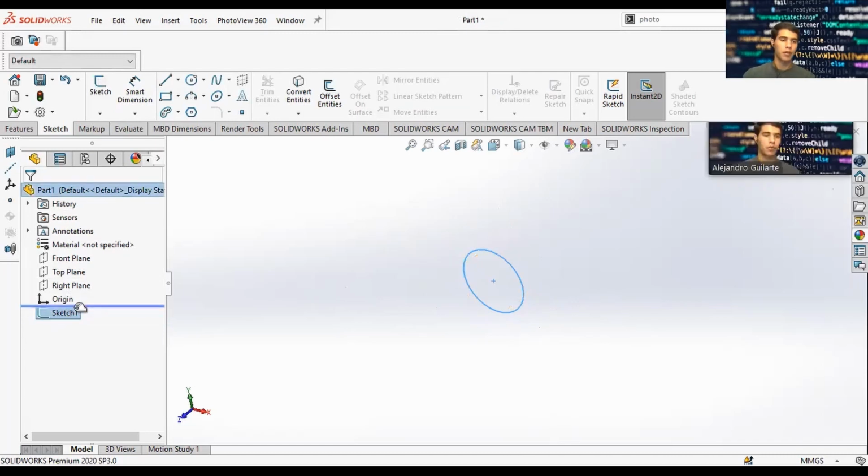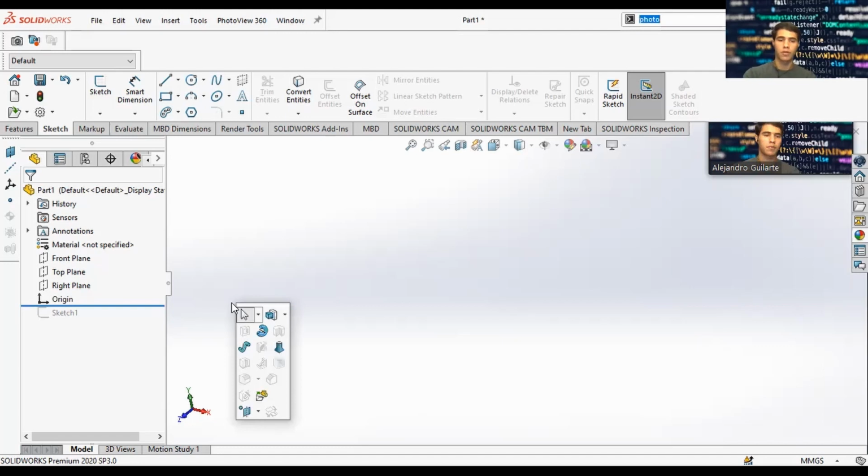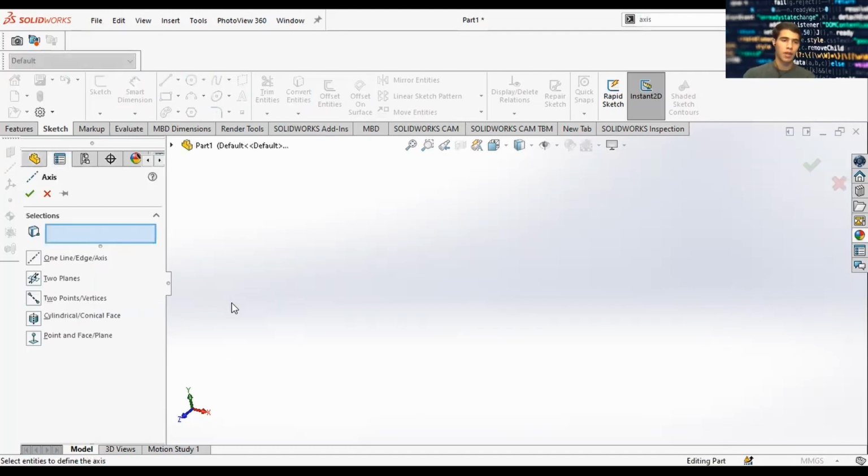We saw this family tree before. We're going to go ahead and roll this back, so we hide our feature. It's no longer on the timeline. What we're going to do now is add an axis. Let's go to our search bar and type in axis. So we can add that axis.